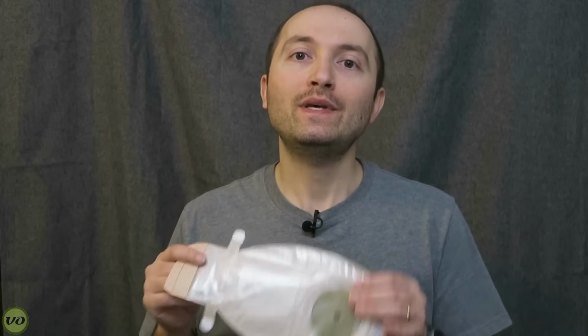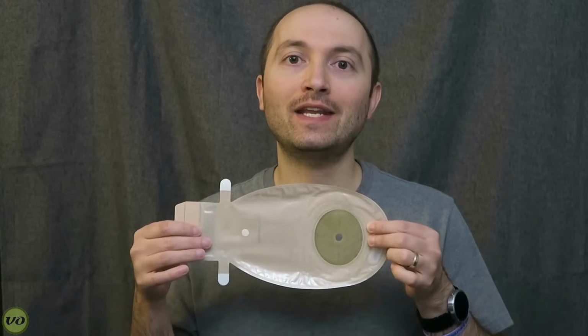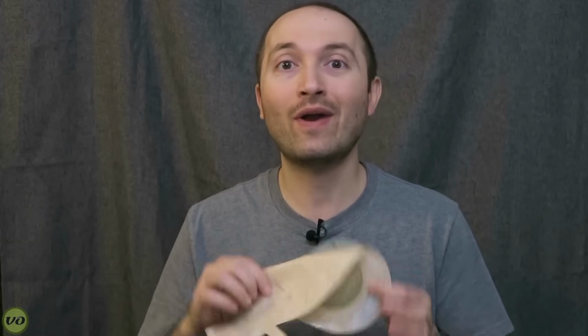Now, for people who like to wear their appliance horizontally like I do, when you have a one-piece system, you basically have to set it and forget it. You can't rotate it afterwards if you have that preference later on. So you're either putting it on one way or the other. You don't have the flexibility of doing it both ways like you can with some of the two-piece systems.